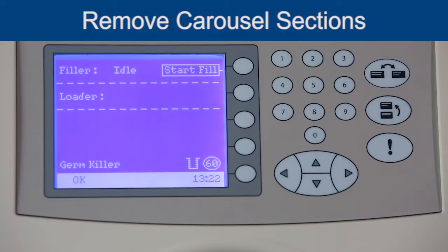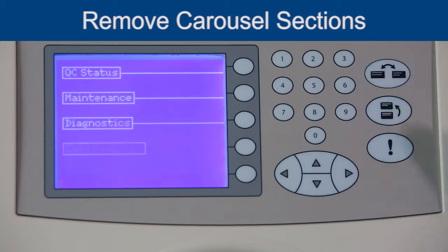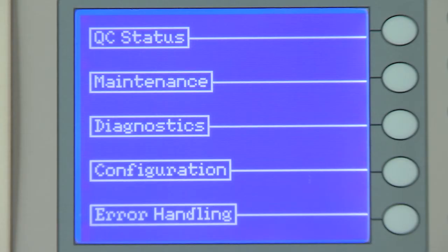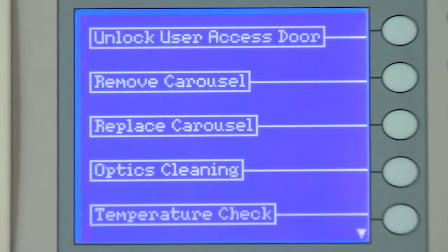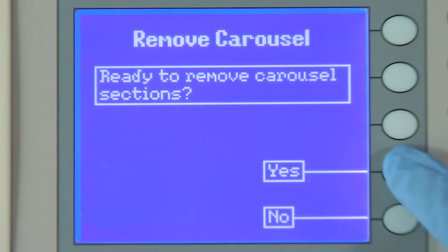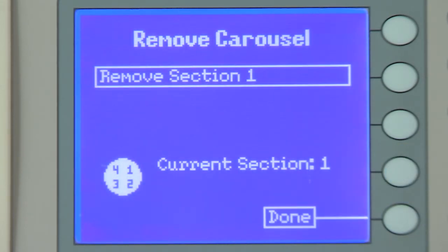From the Status screen, press the Status menu icon. Then press the corresponding function keys to the right of Maintenance, followed by Remove Carousel. After pressing the corresponding function key to the right of Yes, the message on the user interface changes to Remove Section 1.